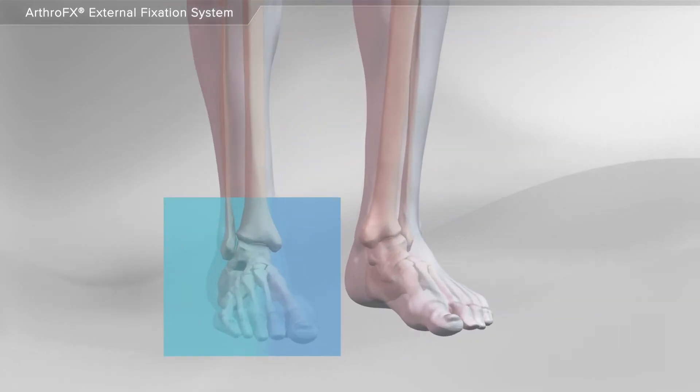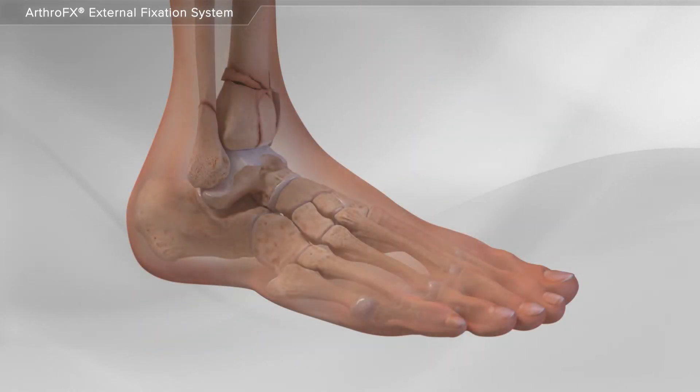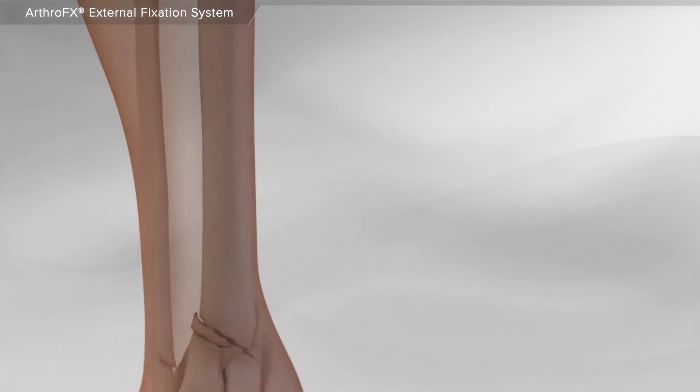In this animation, we will show the application of the ArthroFX external fixator system for a tibia fracture. An external fixator system is commonly used for severe fractures of the ankle and leg to allow for swelling reduction before the final surgery.